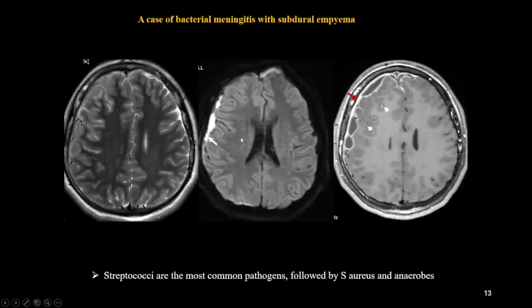In this case, again subdural empyema, but with no paranasal sinus or mastoid pathology. You can see this loculated subdural empyema extending to the contralateral side, as well as leptomeningeal thickening. Streptococcus is a very common pathogen in this kind of pathology and can present with both subdural empyema or subdural effusion. You have to rely on diffusion-weighted imaging: if restricting, you are dealing with subdural empyema; if non-restricting, it is usually a subdural effusion. Other pathogens causing subdural effusions include Staphylococcus aureus and anaerobes.